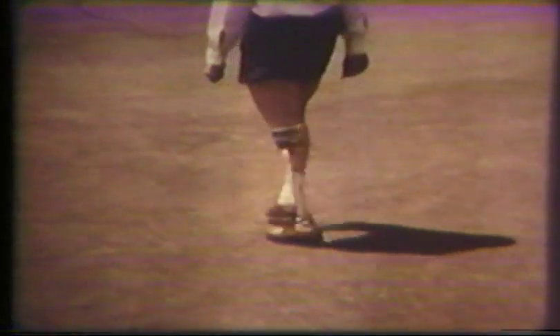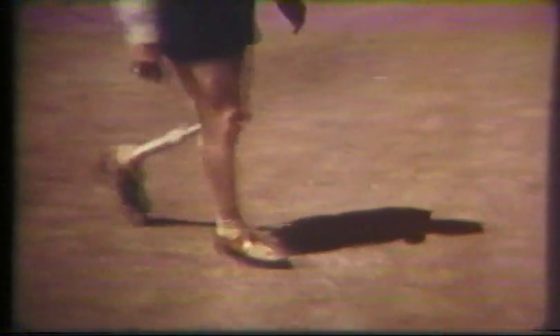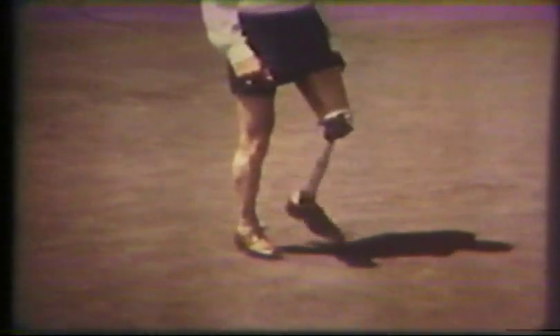It is important to differentiate which of these two factors may be operating from a prosthetic standpoint. Attempts to increase knee friction against an extension aid which is already too strong will simply create further problems. Quite often, in the absence of prosthetic causes, we still see amputees who deliberately create this gait defect. These are patients who like to feel the impact of the knee moving into maximum extension to assure themselves that the knee is stable. Others do it simply for the audible clue noted as the knee reaches full extension just before heel strike. Every effort should be made to discourage this whenever possible. A defect such as this also creates imbalance because the amputee usually pauses during the late swing phase to let full extension of the knee occur. The impact can also be reflected through the prosthesis and cause trauma to the stump if allowed to continue over a long period of time.